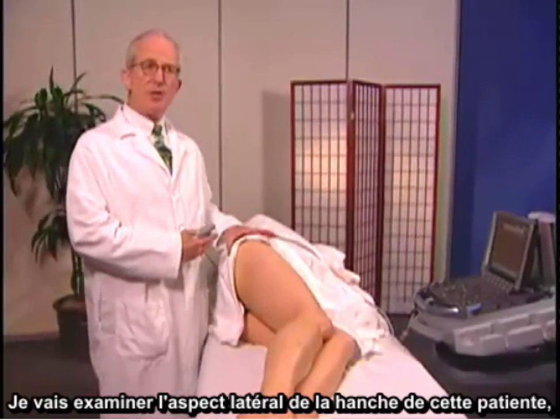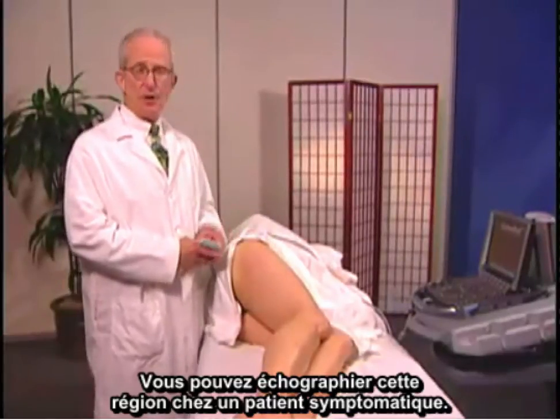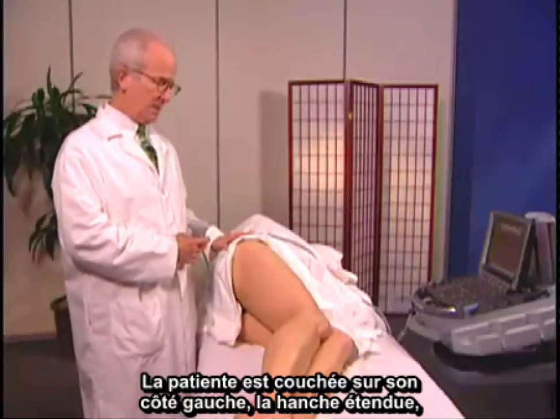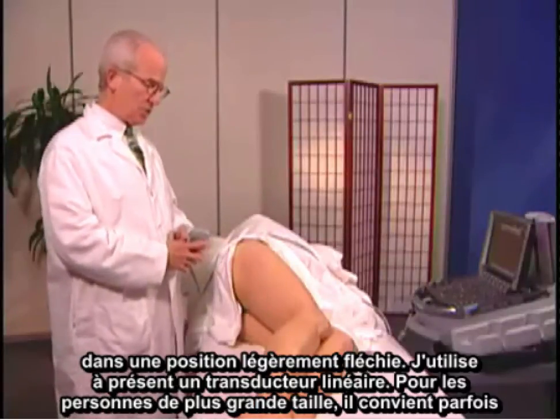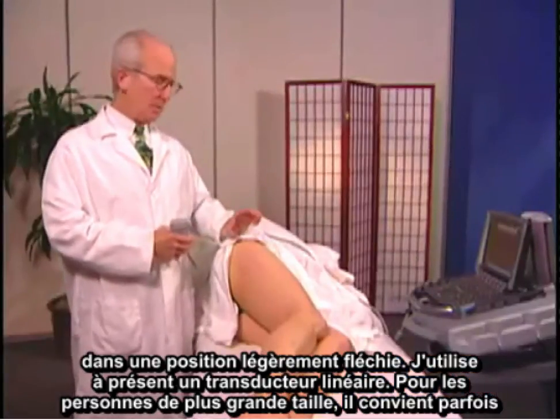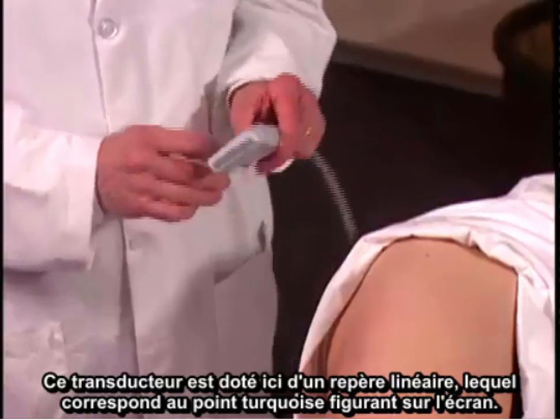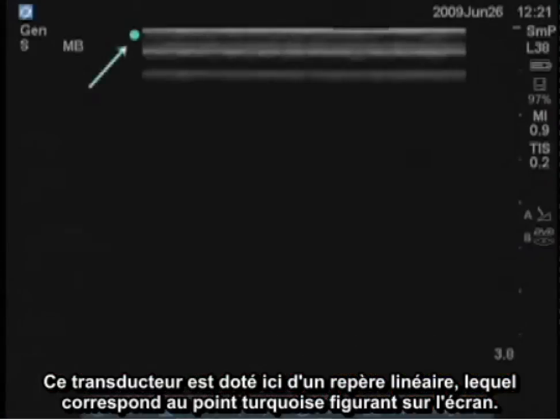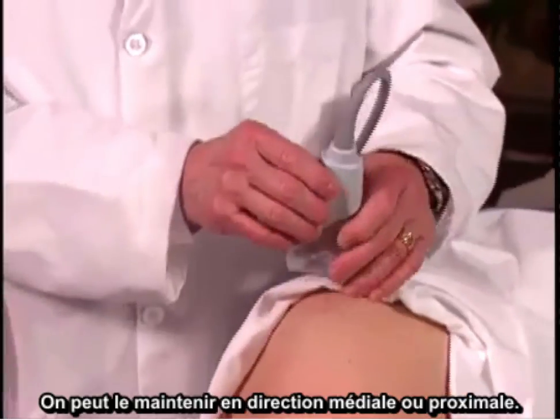I'm going to examine the lateral aspect of her hip, the greater trochanter especially. This would be an area that you can examine with ultrasound in a symptomatic patient. She's lying on her left side with her hip extended, just slight flexion position. I'm using a linear transducer now; sometimes in a person who has a much deeper area to traverse, we might use a C60. This transducer has a linear mark here which corresponds to the turquoise dot on the screen, and we keep that proximal or medial.